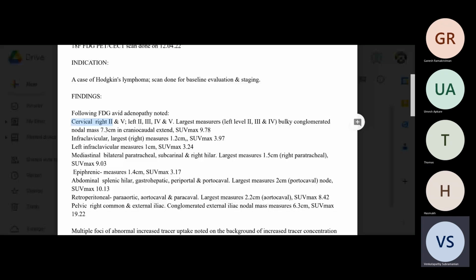that Dr. Ashish shared. Some broader information, though for the specifics Ashish will be the right person to give you. But to give a broader understanding on how to read this report: when we say cervical node, there's a particular region that you're looking at, and when you say levels, so level 1 to 6, there are lymph nodal stations identified according to their location. So according to which node is enlarged, you assign it, and there are certain reference points in the scan based on which you assign. That is how you get the location of the involvement.